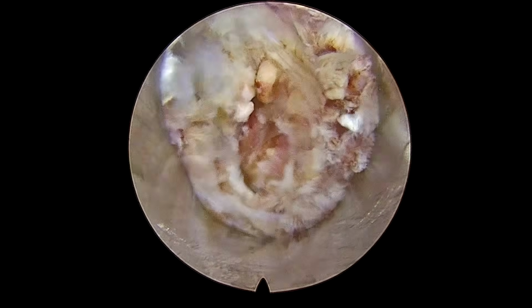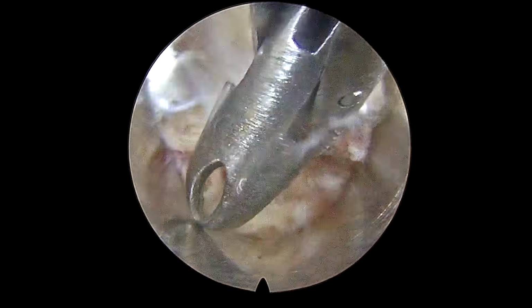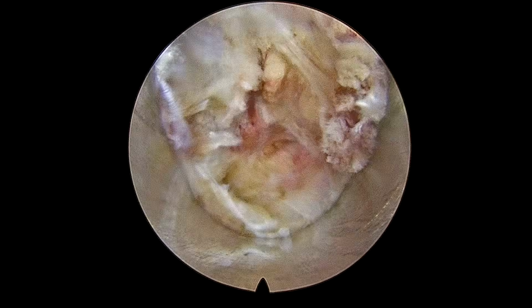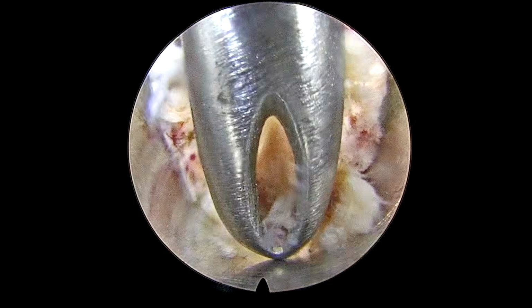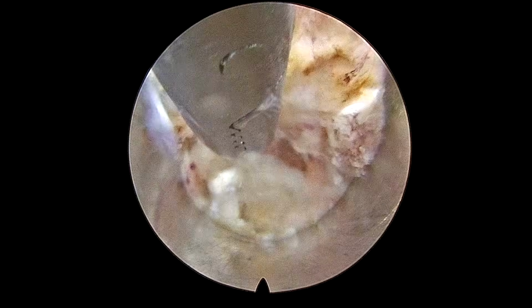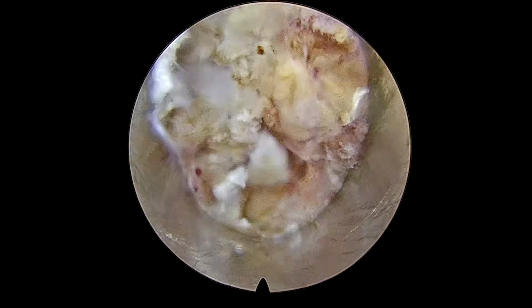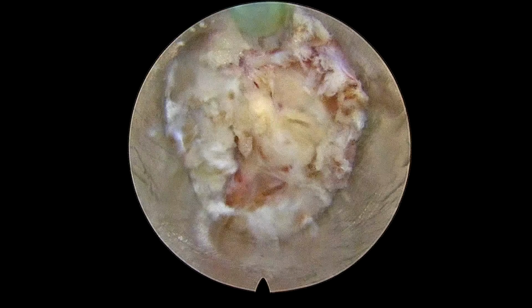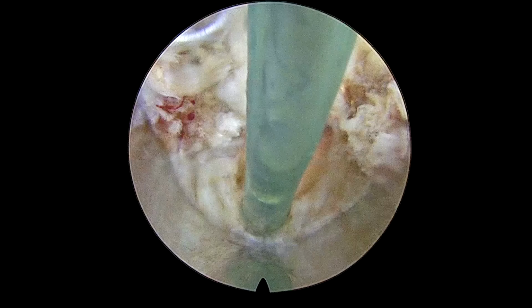So I think the most important step in cervical endoscopy, and even in lumbar endoscopy also, is the identification of your bony landmarks. Because once you identify the landmarks, the further surgery becomes much easier, because you get anatomical orientation of everything. So even if it takes a longer time to identify those landmarks, I would suggest take your time, identify all the possible landmarks, and then start doing the actual bony work.